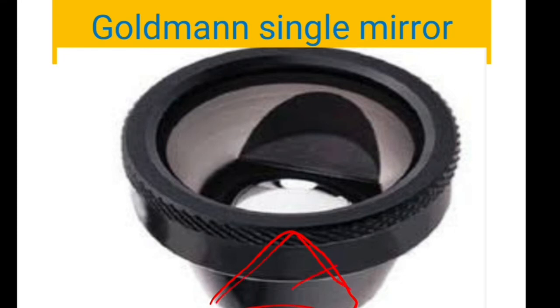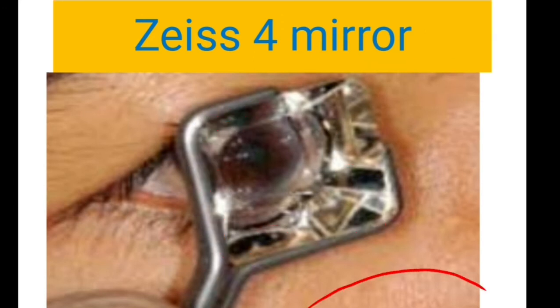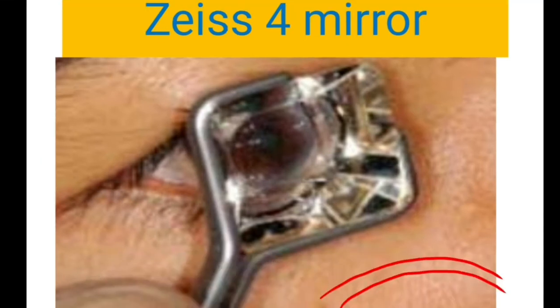So there is a potential space between, and this has to be filled with balanced salt solution or a viscoelastic substance to visualize the angles. Whereas with the ZEISS 4 mirror, POSNER's goniolens or the SUSSMAN lenses, the curvature is very less. The posterior curvature is almost equal to the anterior curvature of the cornea. So here you don't need any coupling fluid.